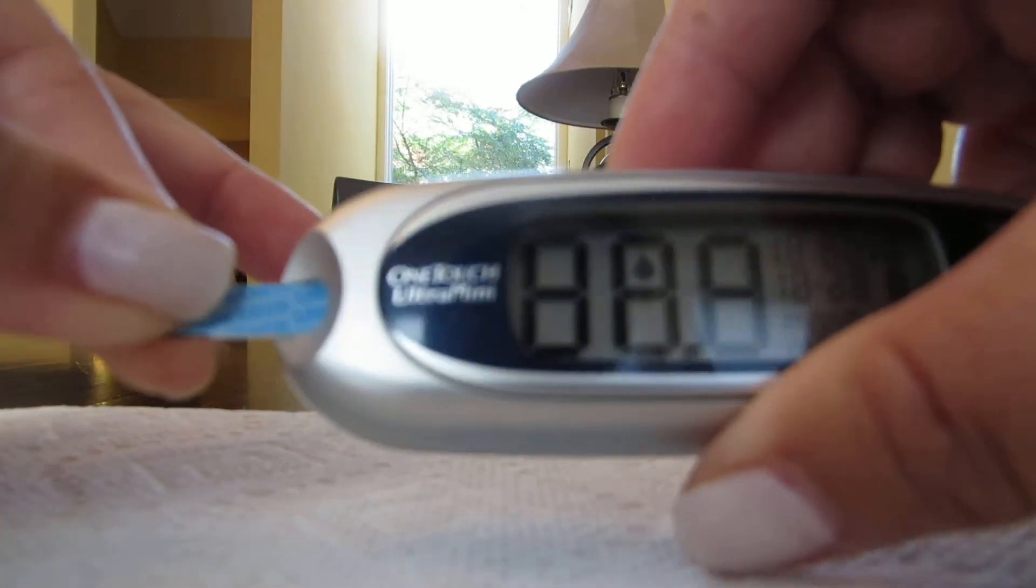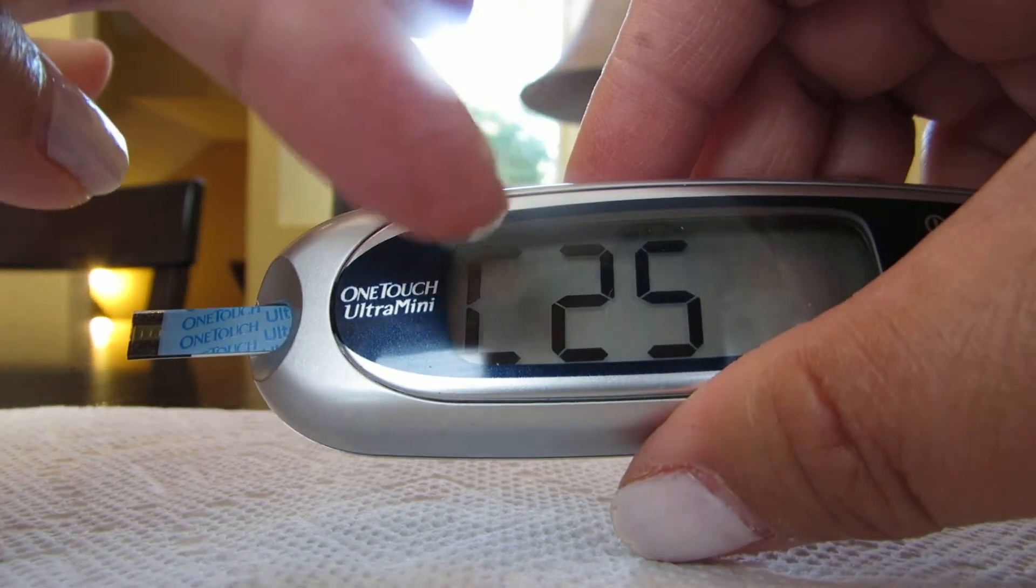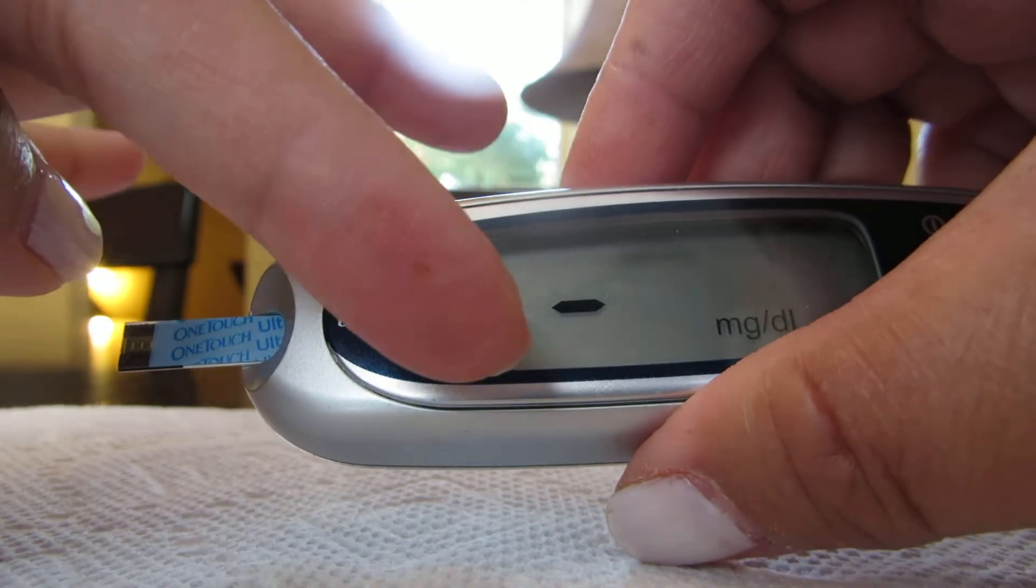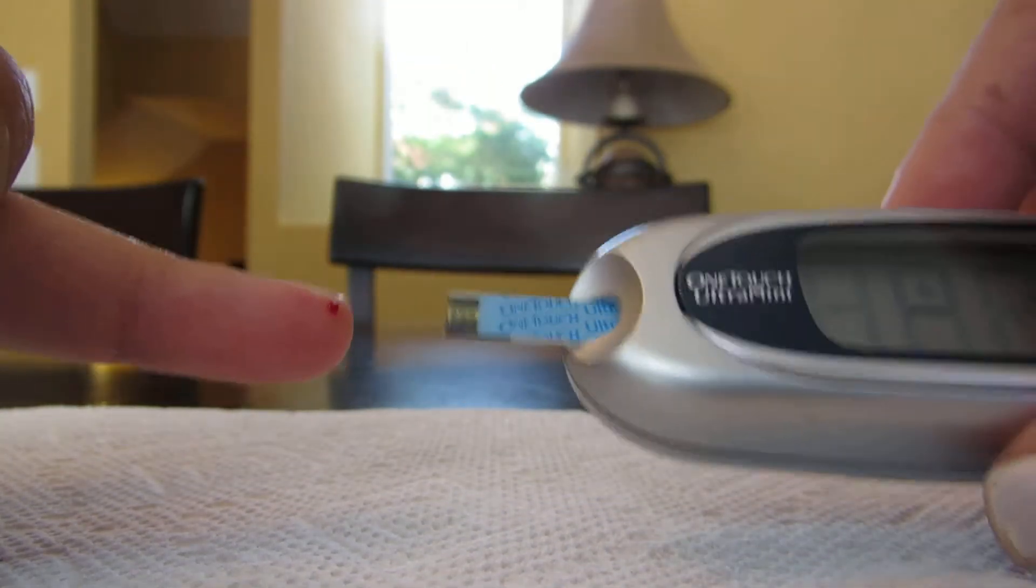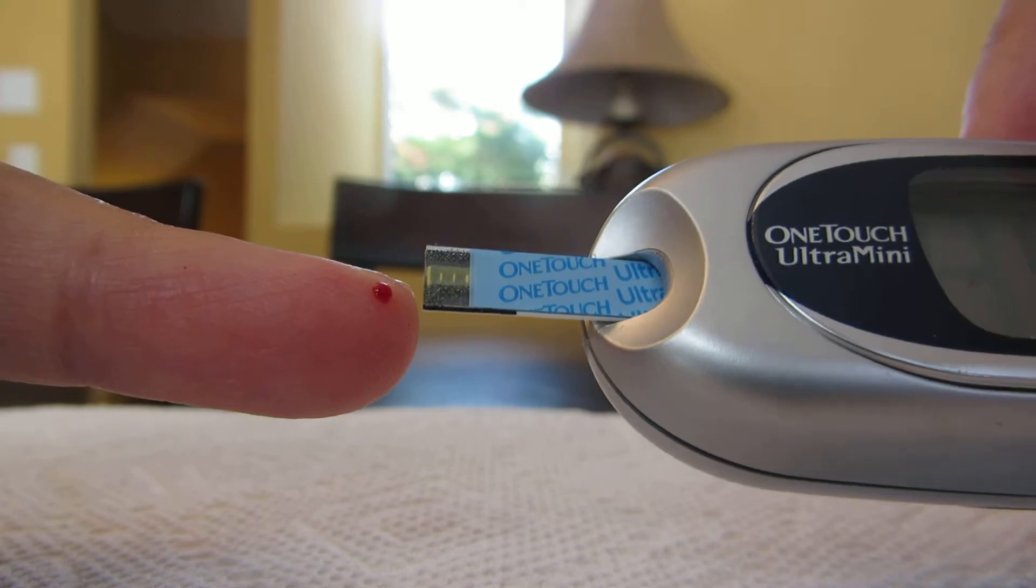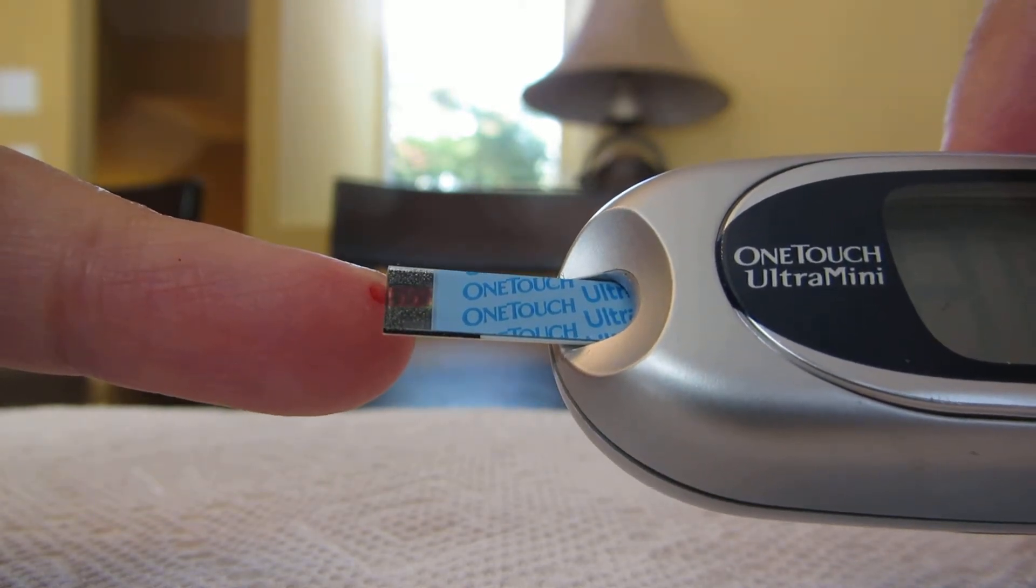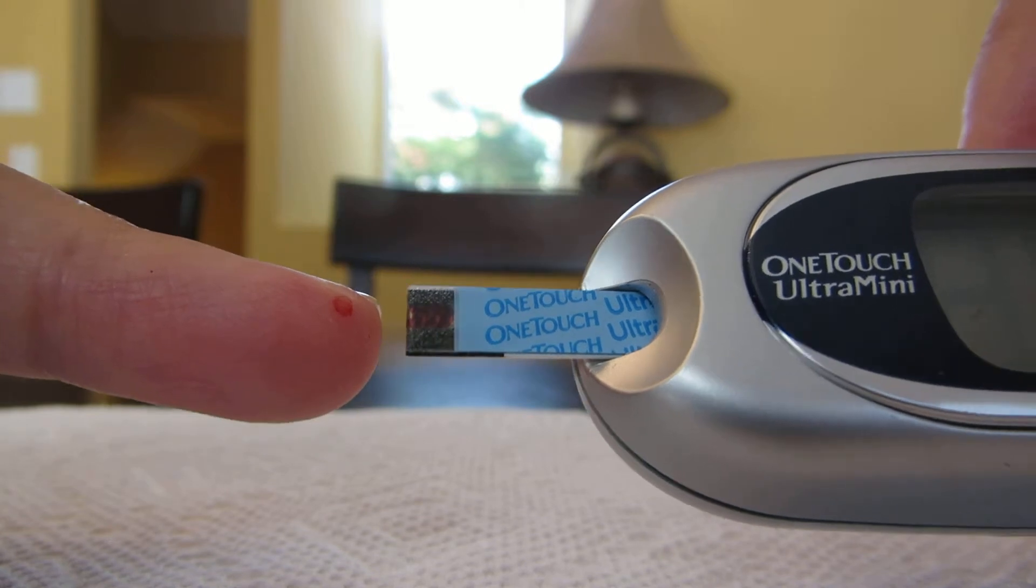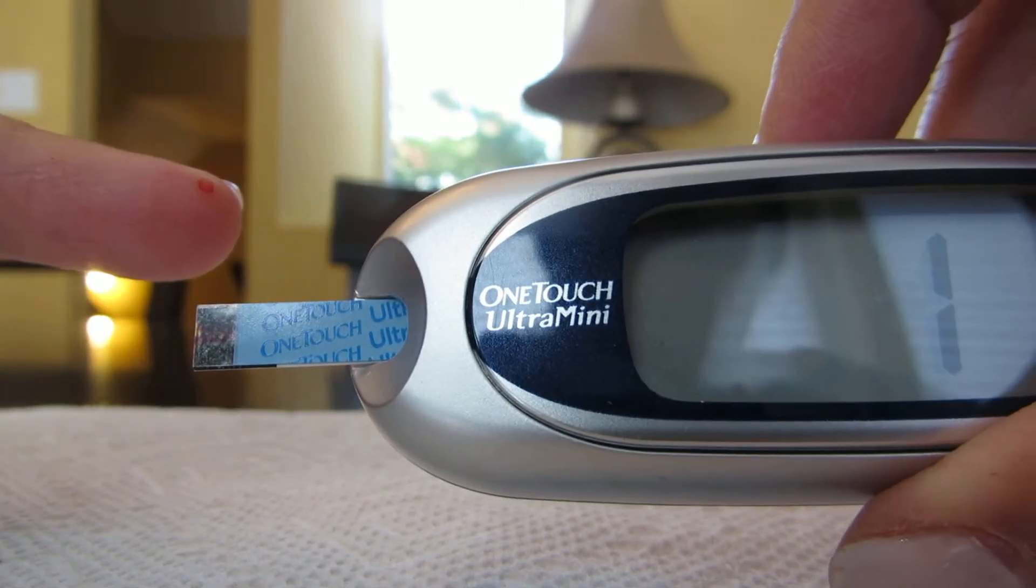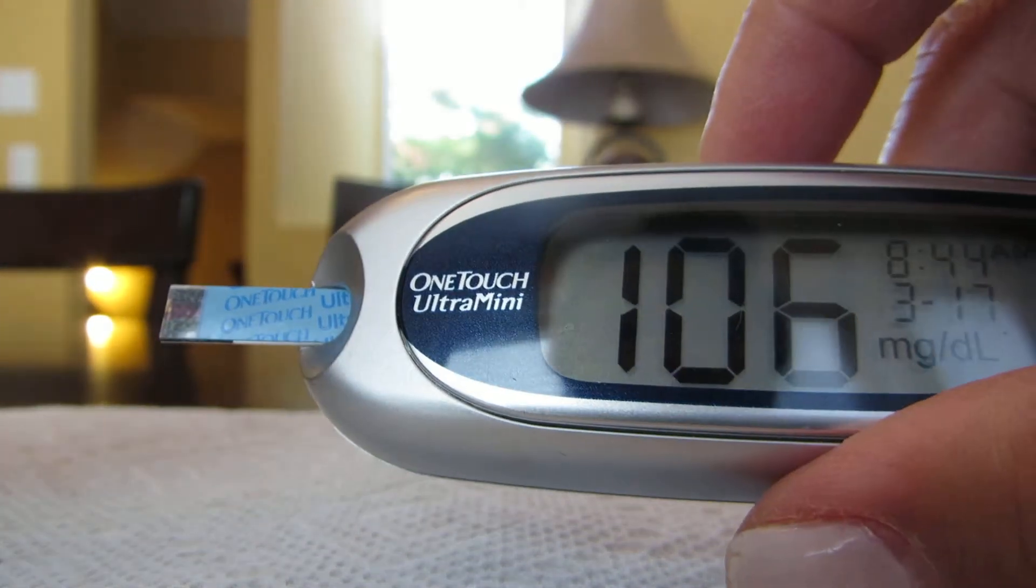That drop of blood—that's when you put the strip. Just touch the blood, don't envelope it. You see it's going to read three, two, one, and my blood level is 106.